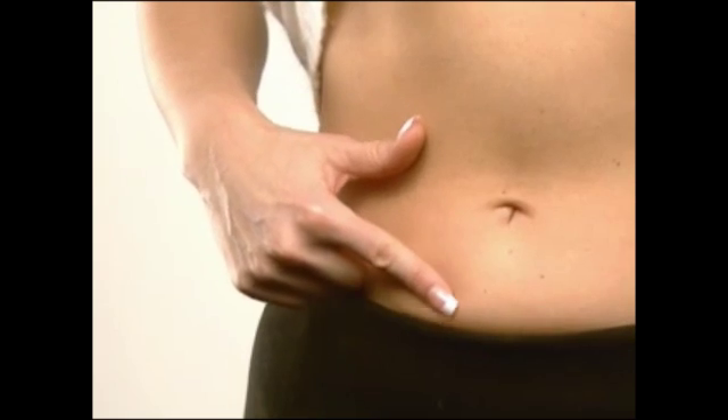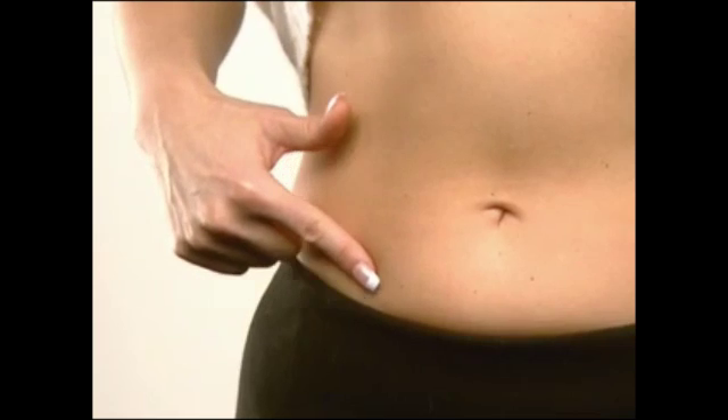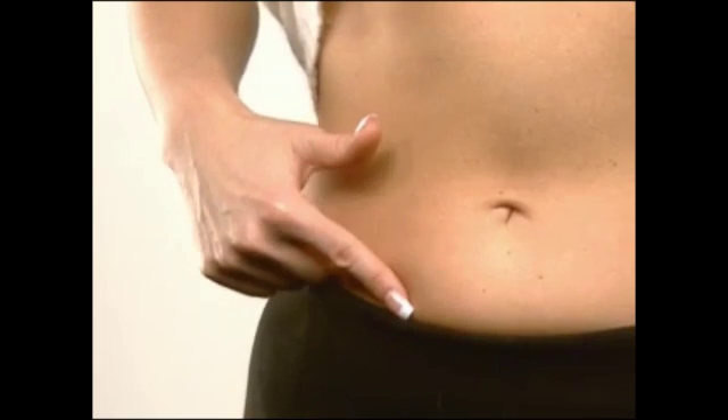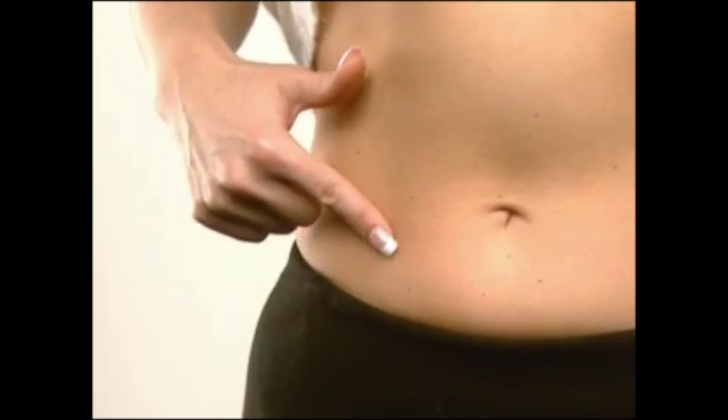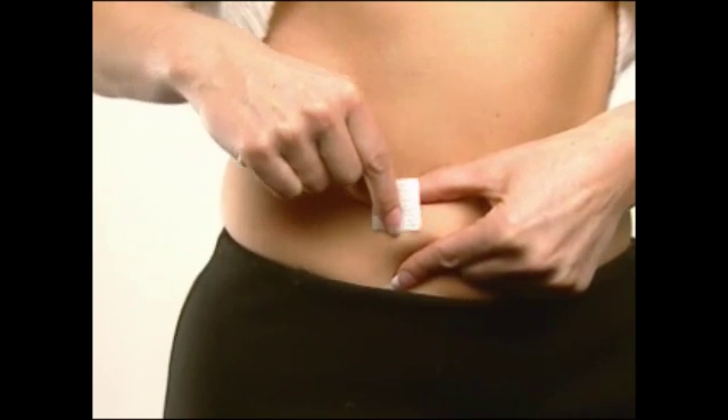Your fertility specialist will have discussed a suitable injection site with you. Clean the recommended injection site with an alcohol swab and let air dry.